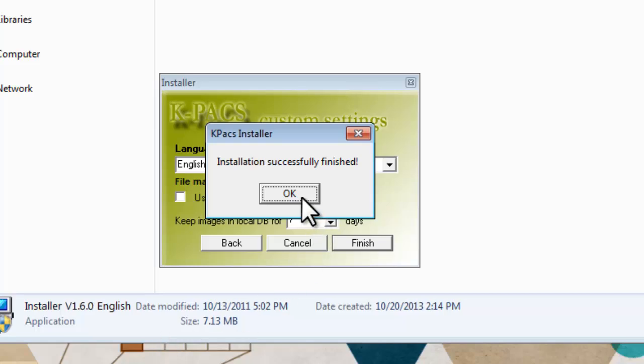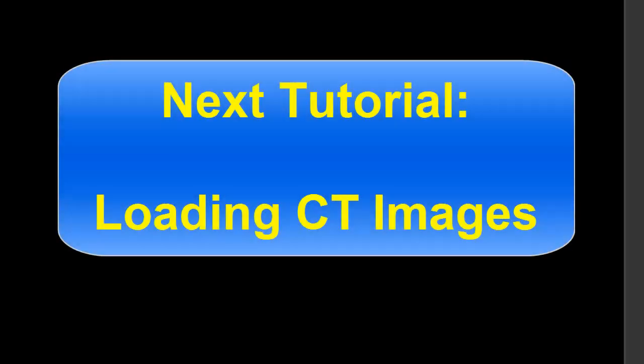You have successfully installed. This ends the installation tutorial. Let's move on now to the next tutorial where I will show you how to load CAT scan images into K-Pax.